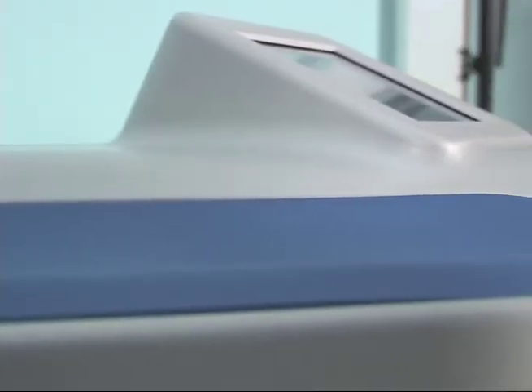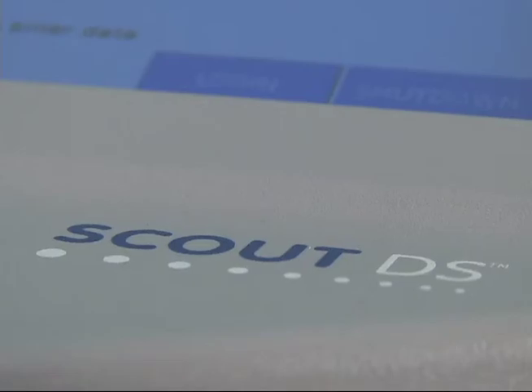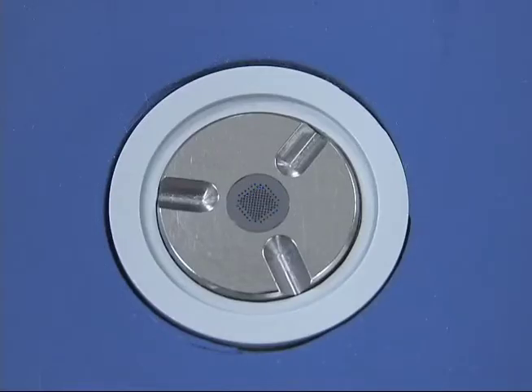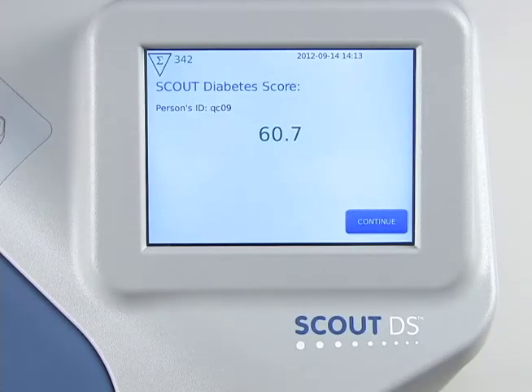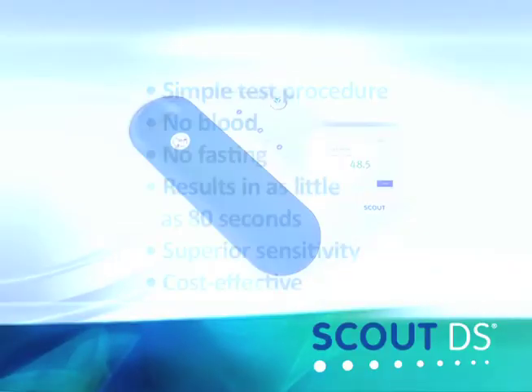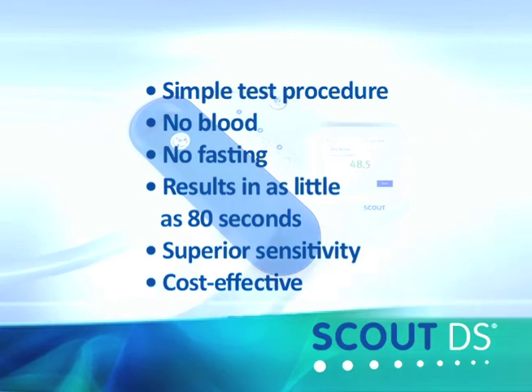The Scout DS utilizes proprietary technology to make a series of measurements using light, which is a painless, inexpensive, reliable test method. In as little as 80 seconds, the Scout DS will display the test results. Simple to use with fast, accurate results — the Verilite Scout DS.